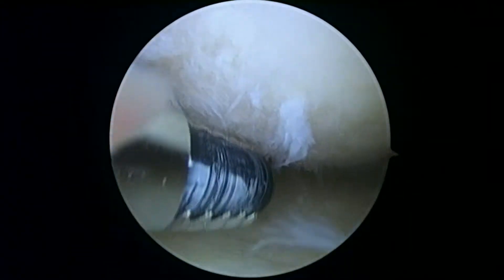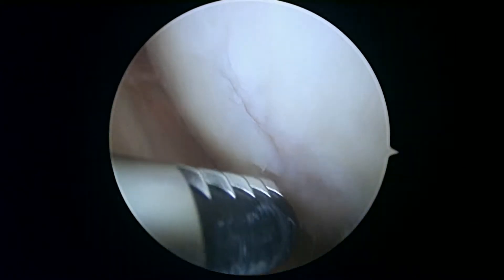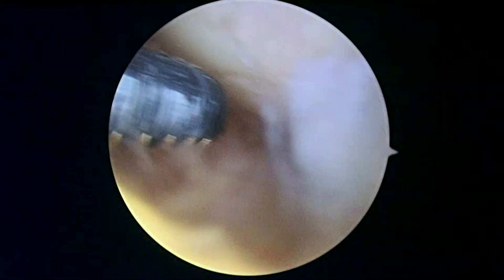It's Dr. Buford. We're going to start on the left knee. This is the medial compartment, or inside of the left knee. As we look at the femoral condyle up above, you can see there are quite a few areas where this cartilage is not in great shape. You've got a fair amount of arthritis in this knee.